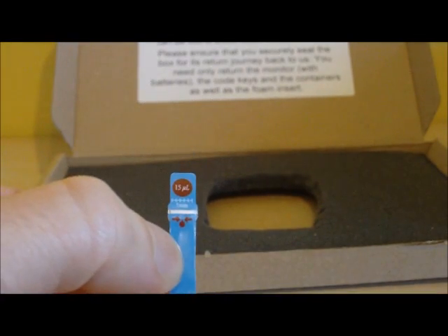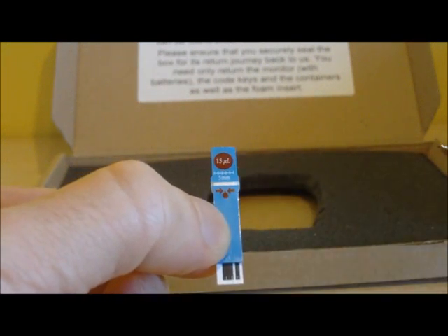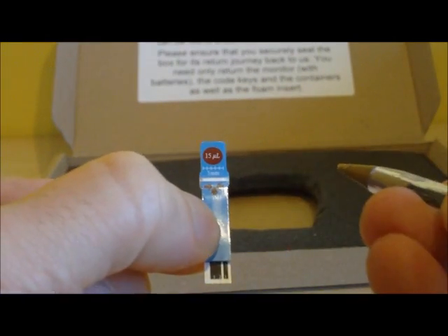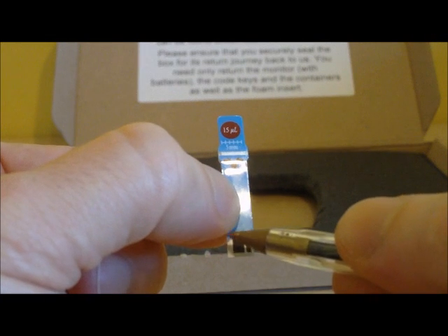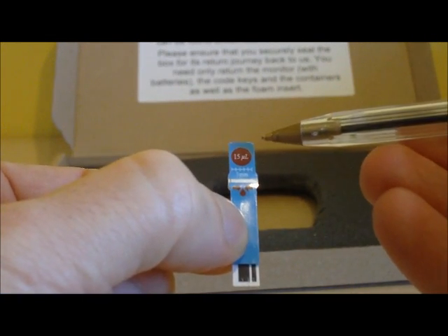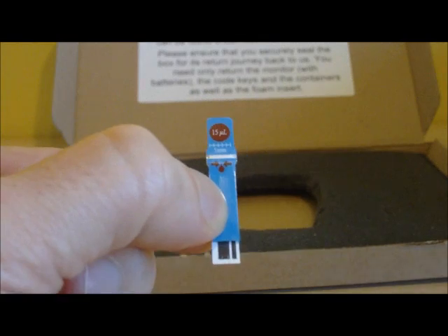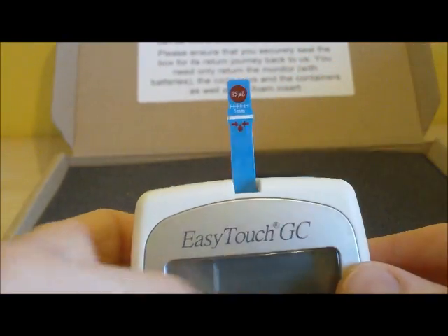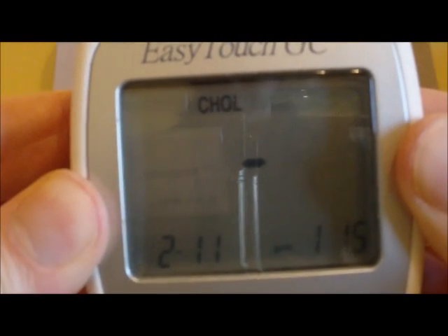Once we have primed the monitor, the next thing is to look at the test strip. The test strip has three key areas: there is a white bar running along the middle where the blood sample goes — applied at either side, soaking along the white area which will turn red. There is also a barcode area at the bottom, which is the part that inserts into the monitor. There is also a guide showing how much blood you need — approximately the size of the circle shown at the top of the strip. Insert the test strip into the top middle of the monitor and it springs to life, flashing the symbol indicating it is ready to receive the blood sample.